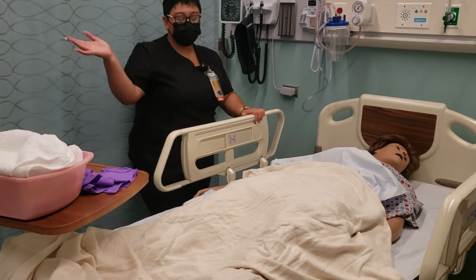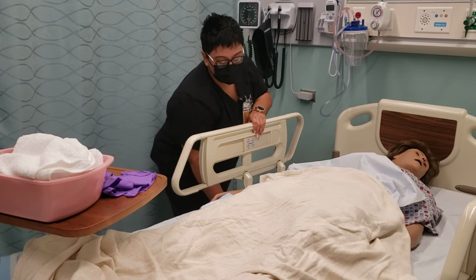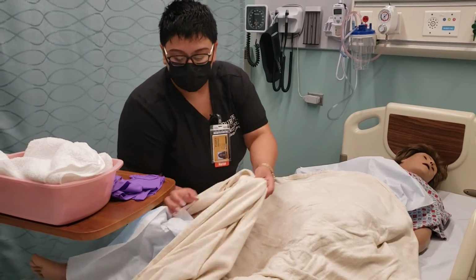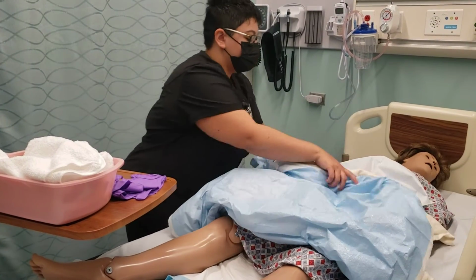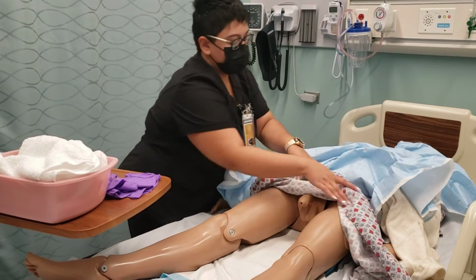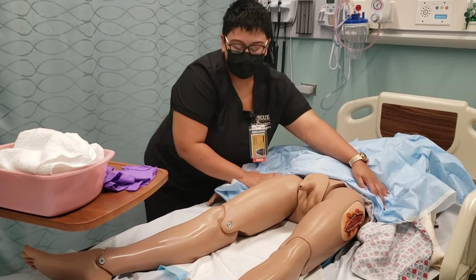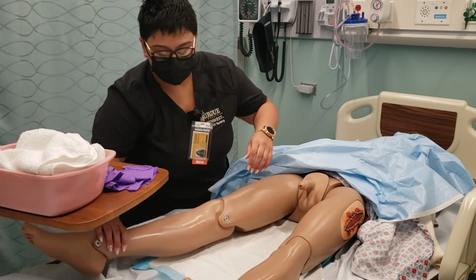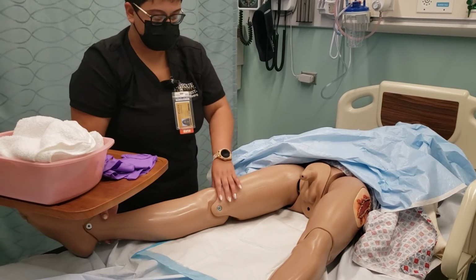Perfect. So I've already closed the curtain and the patient's door, and I've raised the bed to a proper working height for me. And my patient is comfortable in his bed. I'm now going to raise my patient's covers while still keeping him covered. And there's already a chest pad, a waterproof pad underneath the patient. And I'm going to just assist him in moving his legs out for me.